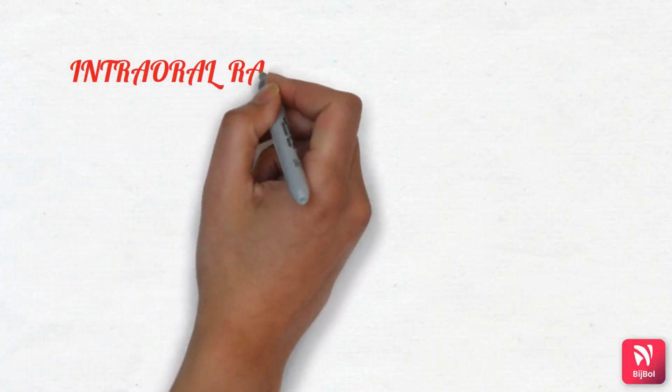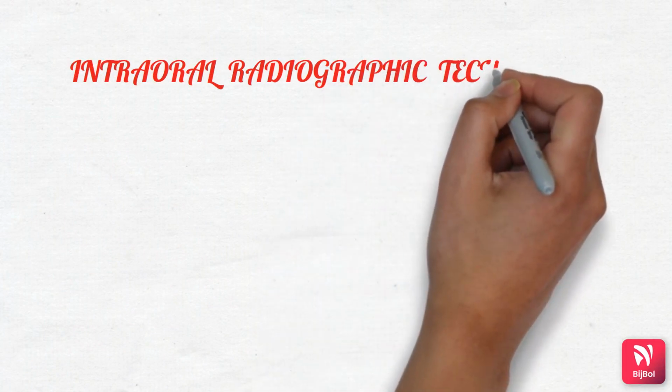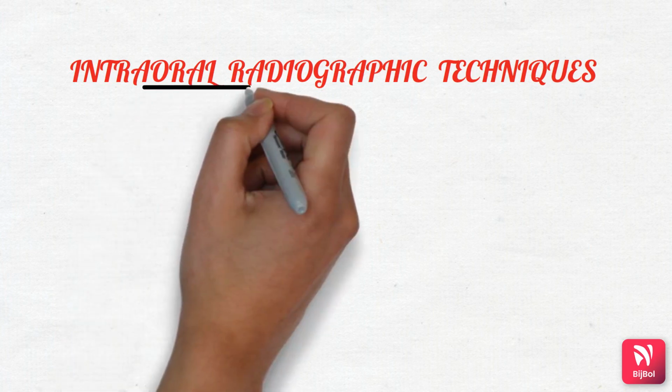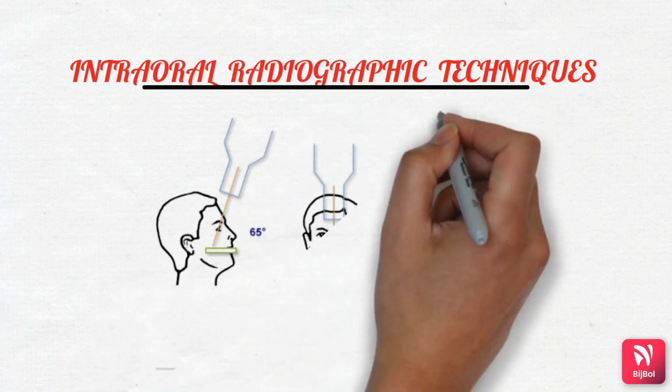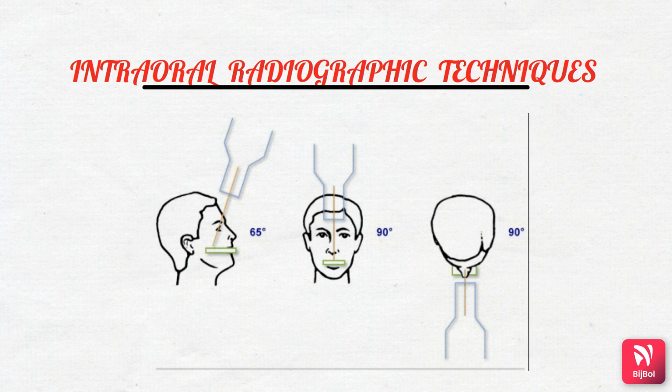The topic of today's discussion is intraoral radiographic techniques. As in the previous session, we discussed the different intraoral techniques like the paralleling and bisecting angle techniques. Today, we will be discussing the different angulations and projections used for each technique.